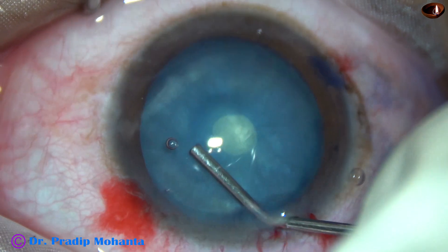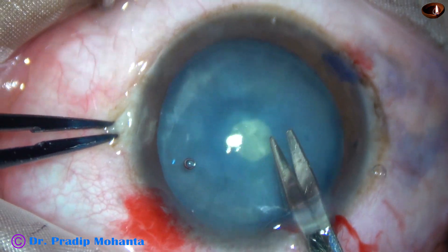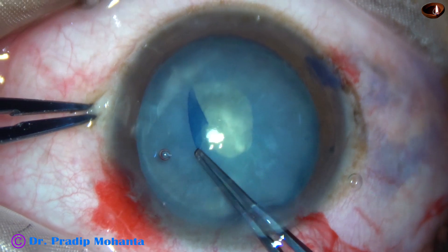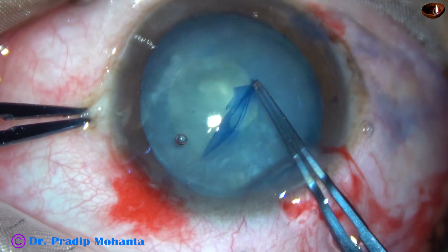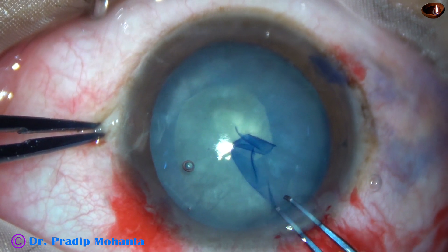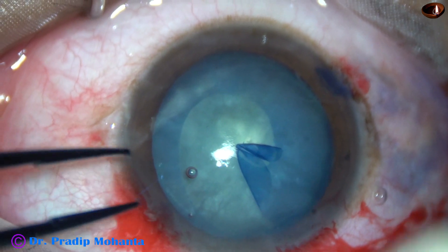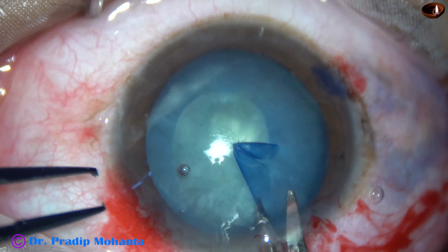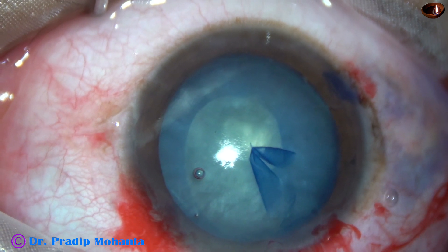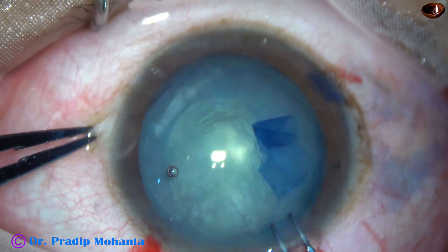And now my plan is to enlarge this mini-rhexis into an optimum-sized one. A small cut is made at around 8:30 o'clock with Vannas scissors. The utrata forceps is taken again. The capsule flap is held. Now watch very carefully — suddenly it goes to the periphery, and it has gone to far periphery. It is irretrievable. If we pull it vigorously, we will just cause zonular dialysis. So I have taken Vannas scissors and made a cut. Now I use some viscoelastic to push the capsular tags downward, and take the utrata forceps again to complete the rhexis.